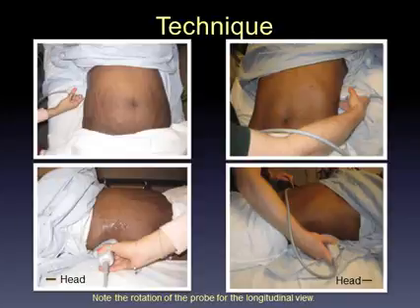And here we have pictured the starting positions for the renal ultrasound. It's essentially the same as the FAST scan, which I'm sure you're familiar with. On the patient's right-hand side, that is the liver side, we begin with the probe in the mid-axillary line around about the 8th or the 9th to 11th rib space.